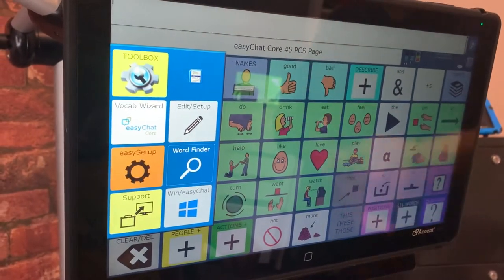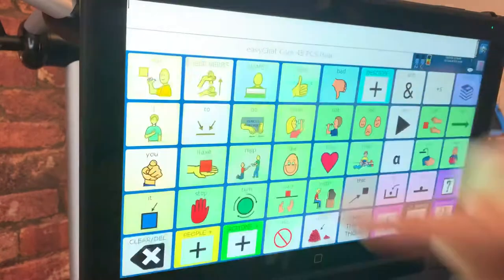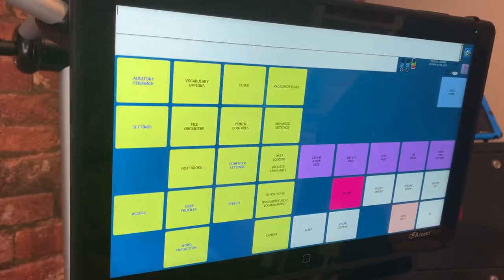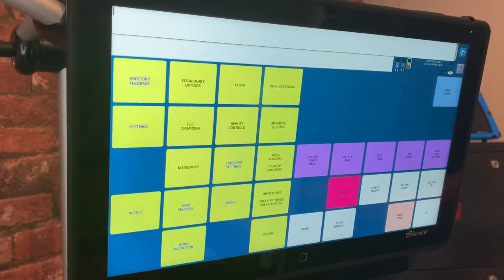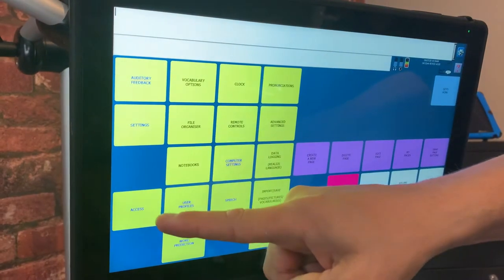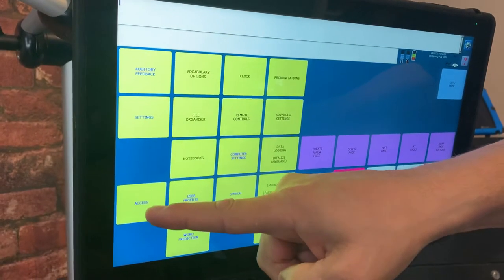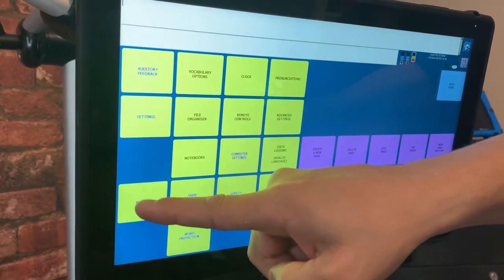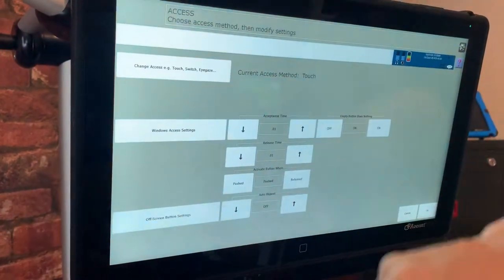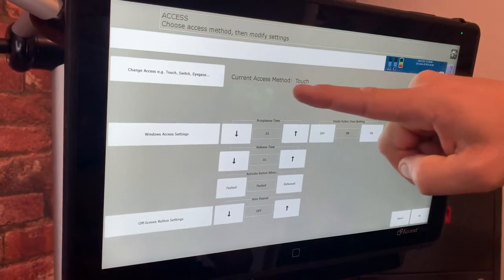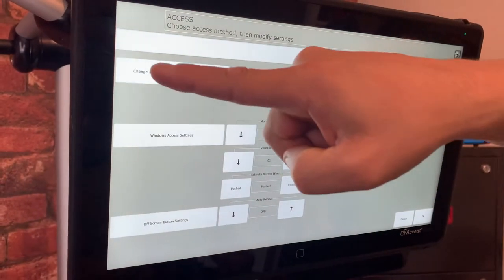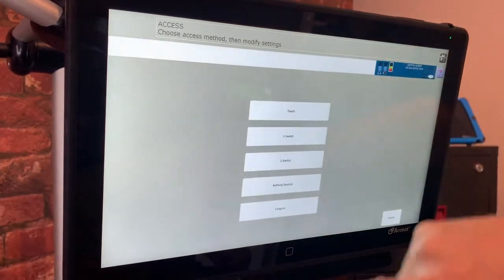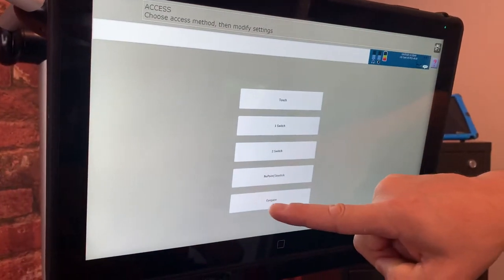I can then go into Toolbox and by going into Toolbox it allows me to change the access method and the access method can be found under this menu here. This allows me to change it so I activate Eye Gaze. I'm currently using Touch so I'm changing access method and I'm going to select Eye Gaze.